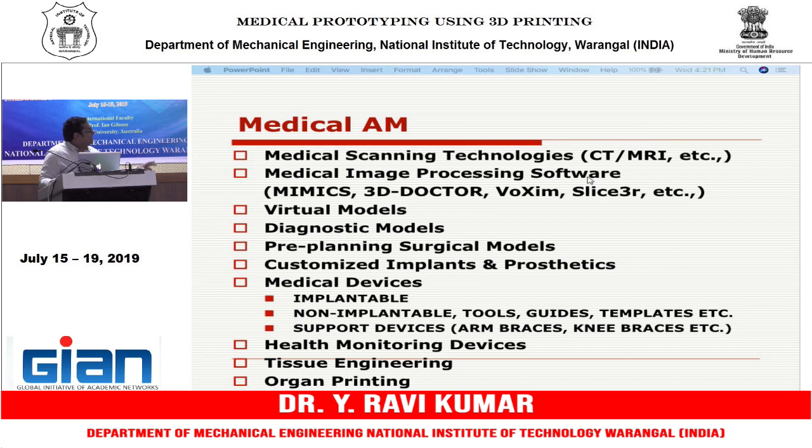Briefly, what are the activities in total in medical AM? Of course, what is the start point of this procedure? The start point is patient data acquisition. You collect the patient data by several methods, either CT, MRI, PET, ultrasound, or endoscopy, but you digitize it and take it as an STL file, right? That's what a 3D printer takes, only an STL file.